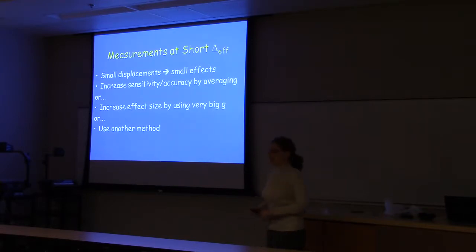Another way to get bigger phases: if I put a larger gradient on in this room, the steps between the notes that I played for you are going to get bigger. So the front of the room will have a really low note, and the back of the room will have a really high note. Now the difference is big enough that maybe we'll detect it. The problem is these gradients are magnetic fields. We've got to turn them on and turn them off really rapidly, especially if you're trying to make the time really short, on off real quick. dB/dt, electric field. Electric field on the body is going to be bad.